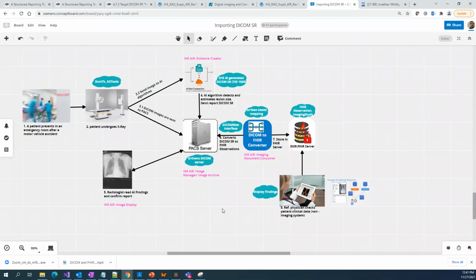So, like you said, Siemens already has IHE, and probably Philips also has it. Is it a fair assumption? IHE is there in any radiology system you take. It's compulsory if you want to sell, at least in Western countries. Unless you pass IHE connectathons, that is a mandatory criterion even for your initial listing.